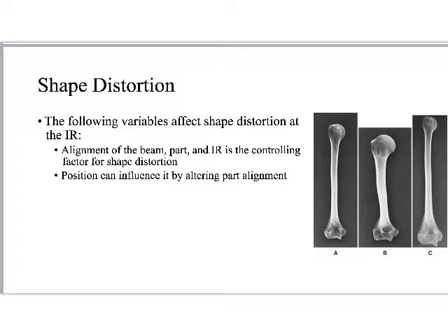Just be really careful when we use those terms. The registry is very specific that AP and PA relate to the projection. Positioning terms are things like oblique, right? Or supine.